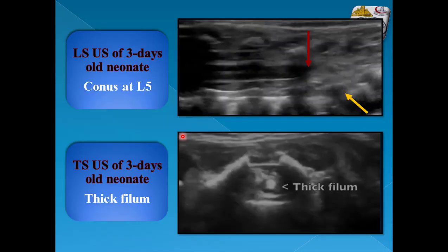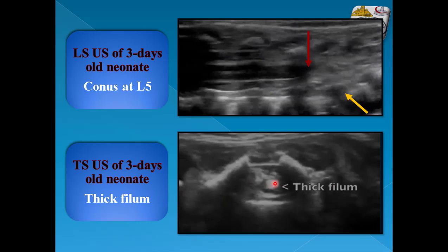This is an example of longitudinal ultrasound examination of a three-day-old neonate. The conus is at L5. By TS, there is a thick filum exceeding 2 millimeters in diameter — this is the thick filum terminale.